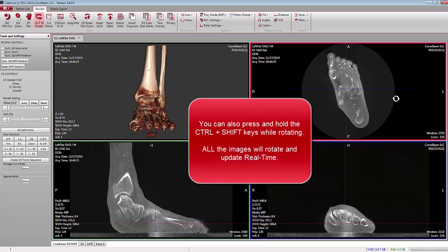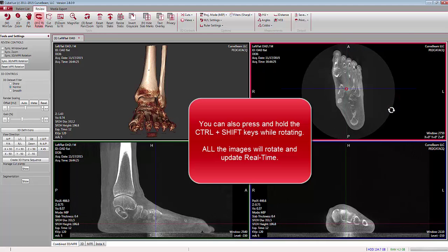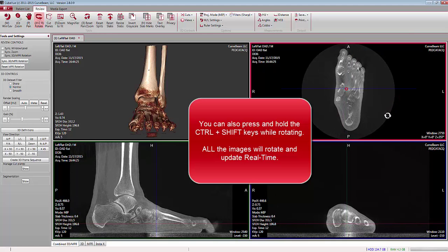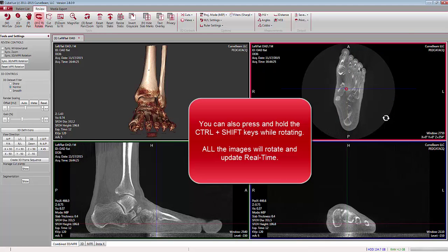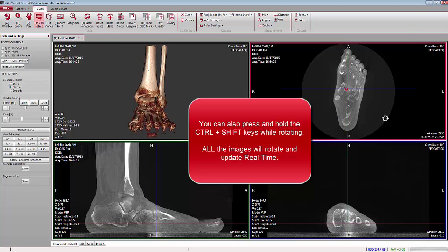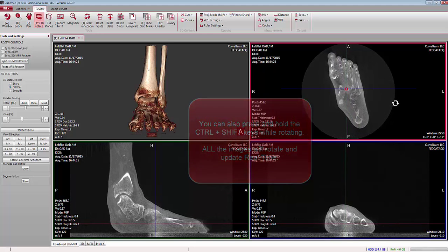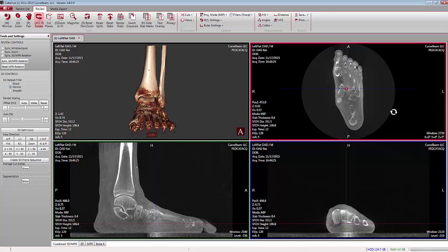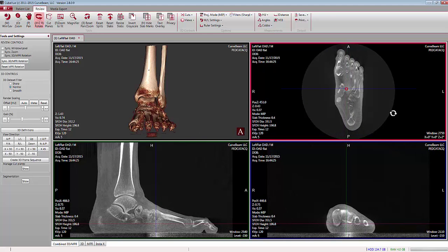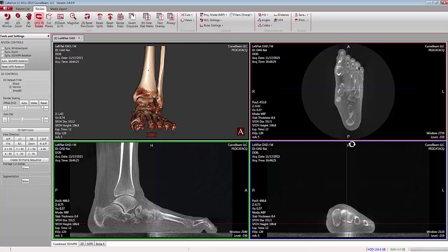Also, if you press and hold the Ctrl and Shift keys at the same time, all of your views will rotate simultaneously. Again, Ctrl and Shift — all of your views rotate live and simultaneously.